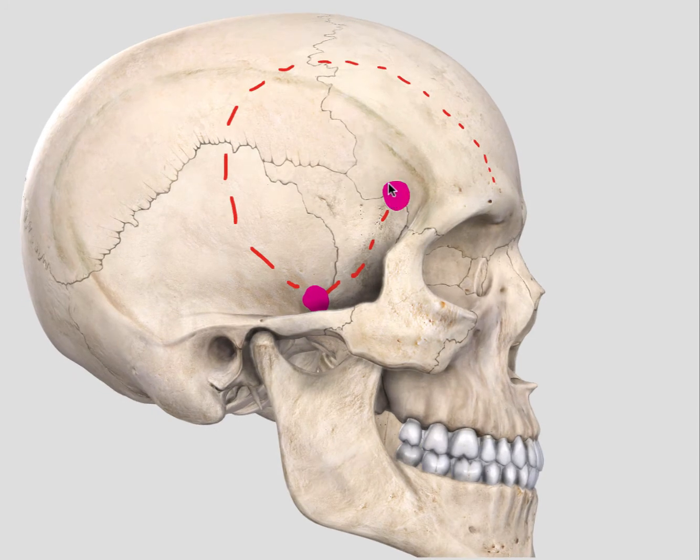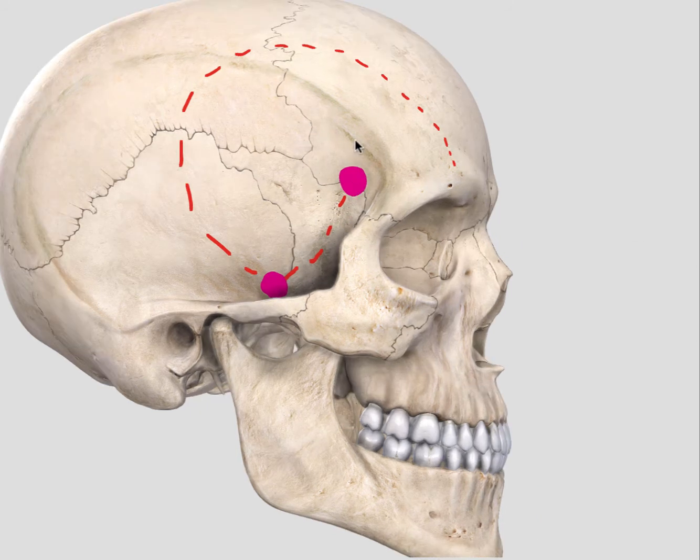It's important to get your McCarty's keyhole burr hole in the right place. That burr hole will allow opening into the frontal fossa as well as into the orbit. For this modified one-piece craniotomy, this keyhole burr hole is very important.